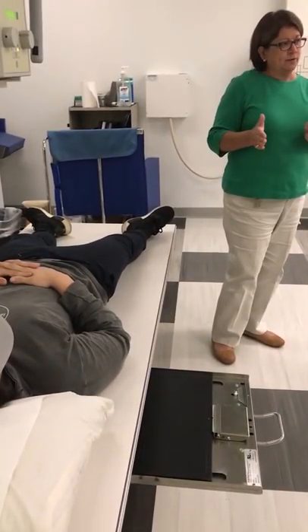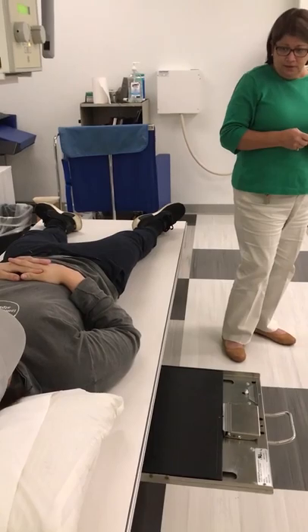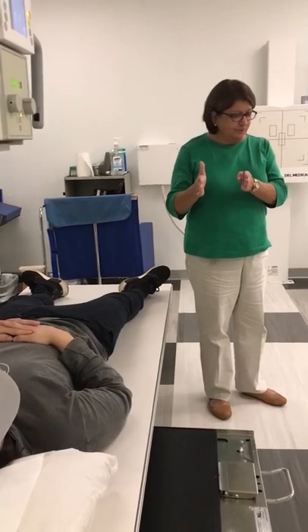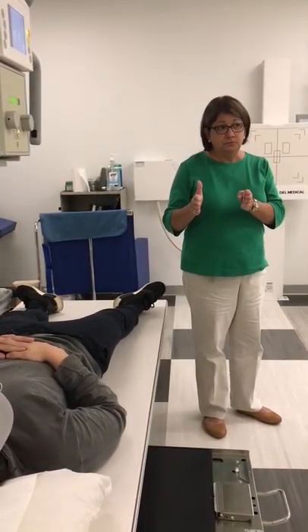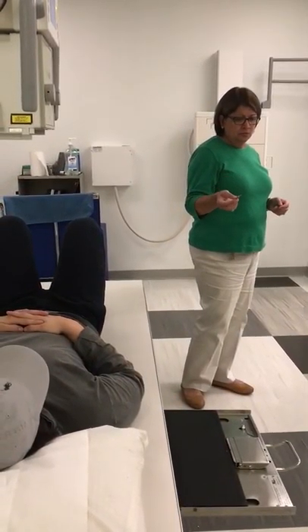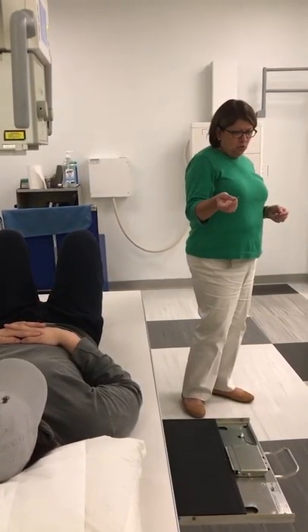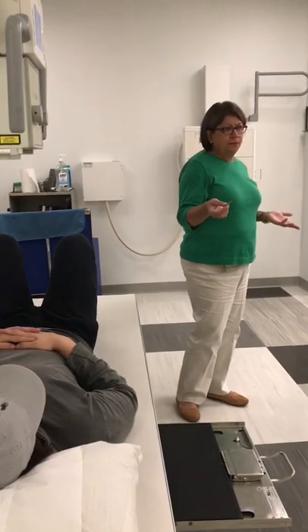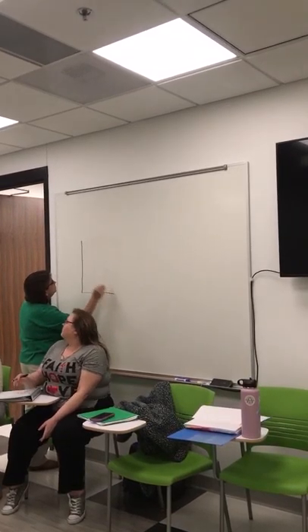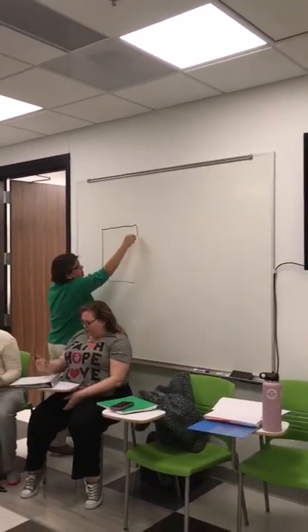What is the collimation width on all of these? It's about like 6 inches. 6 inches. Thank you. So for all of these esophagram projections, the width of your collimation field is going to be 6 inches. You know that you have to place the marker within the collimation field. So if we're collimating to 6 inches, how do we know where to place our marker so that it will show up in the image? And this works for the esophagram and any other exam where you need to place your marker not at the outer edge of the IR.